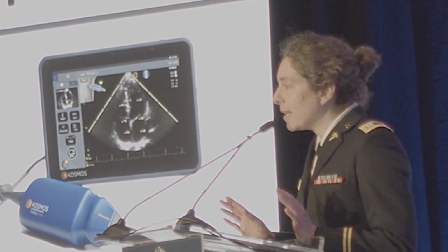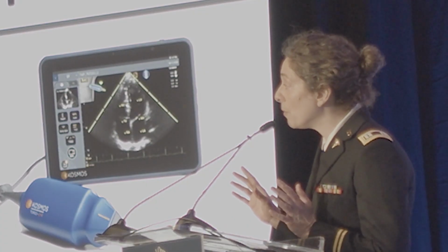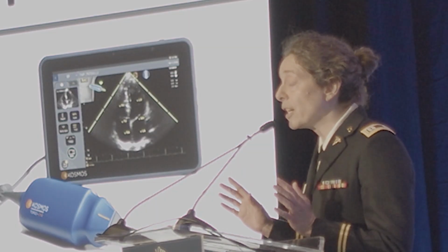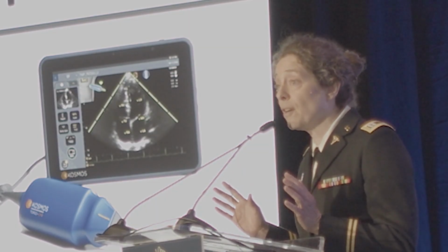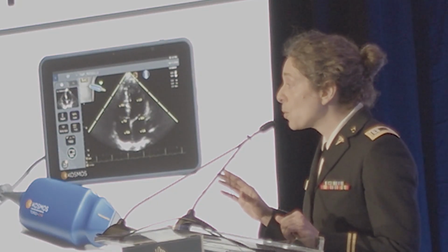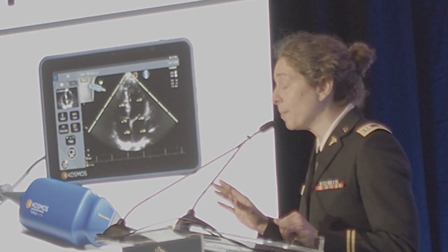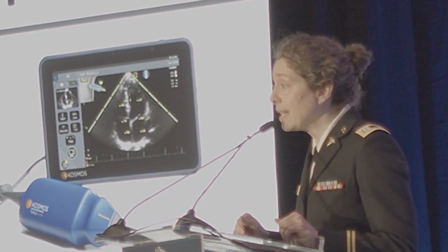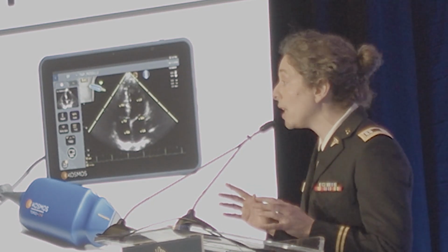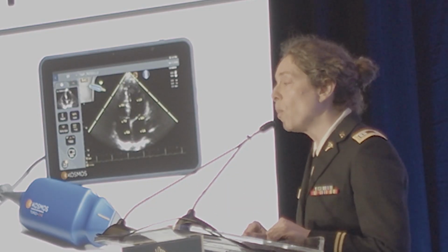Our methods involved taking all of these ultrasound systems to a semi-remote field in Fort Cavazos, which models the electromagnetic operational environment. Using a Rohde & Schwarz PR200 portable spectrum analyzer, we measured the electromagnetic signature of each ultrasound system at a close range of less than 10 feet, both while the system was on and while it was being used to scan.